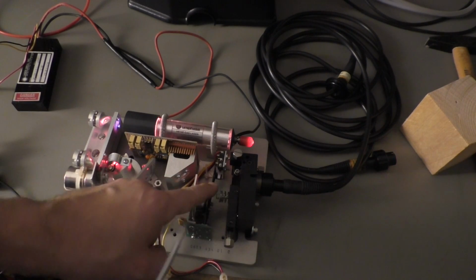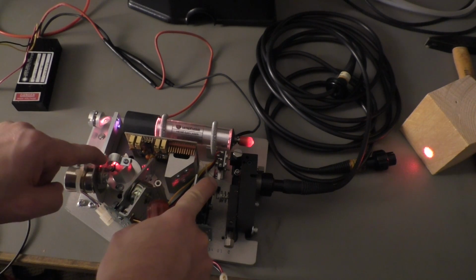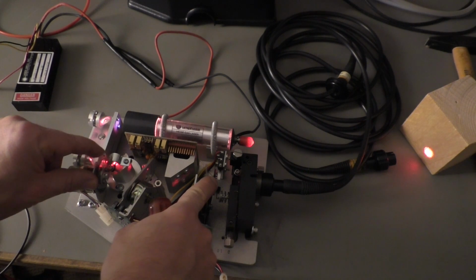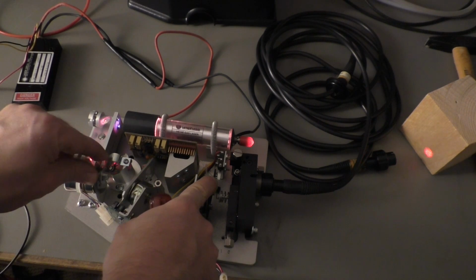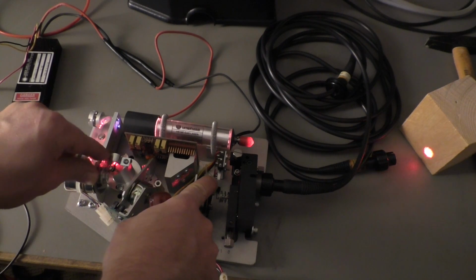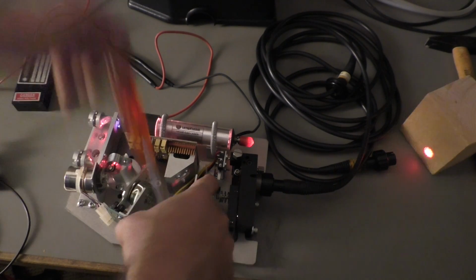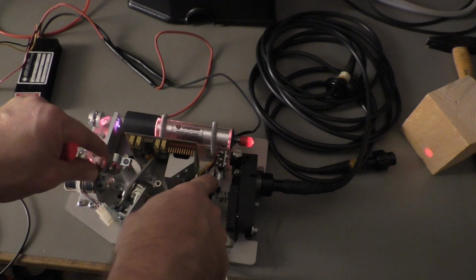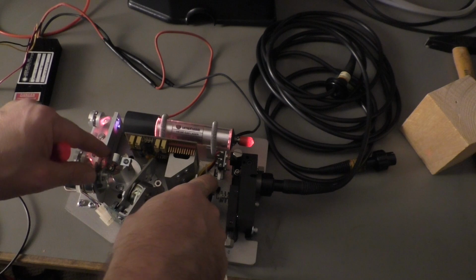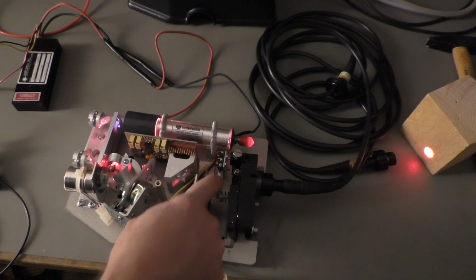and ends here. Now there is another wheel on this side, and this is a rotating polarizer, and its only purpose is to change the intensity of the red aiming beam. You can see it down here. Now it's almost gone, and now it's on full energy. Shutter here.